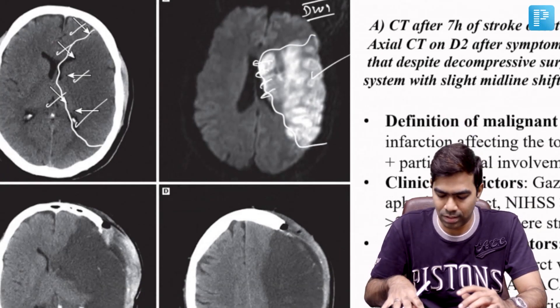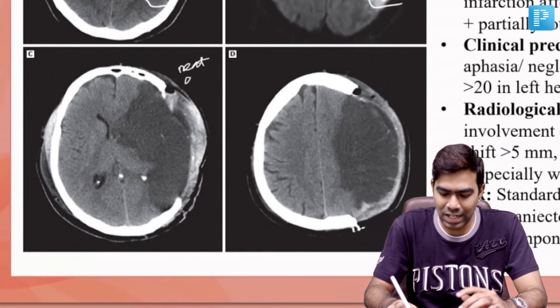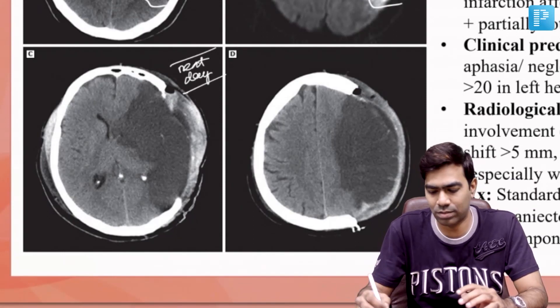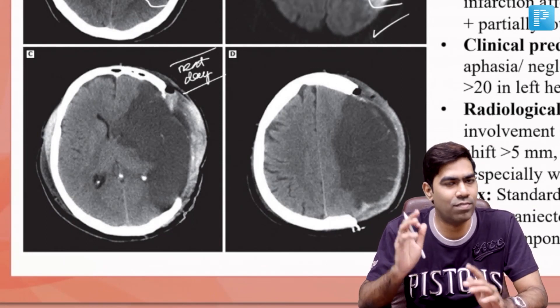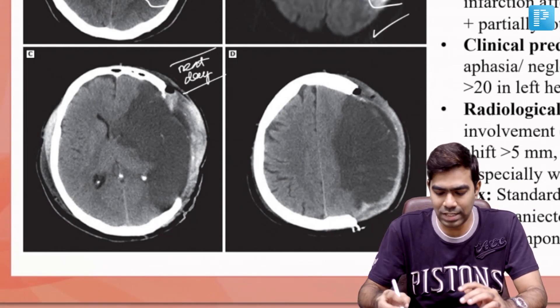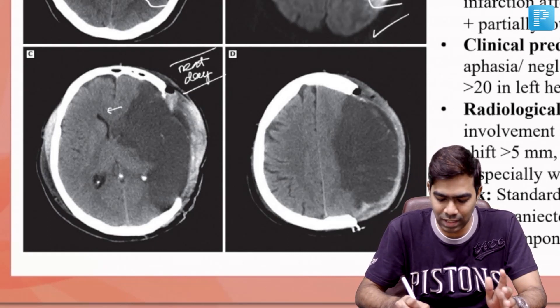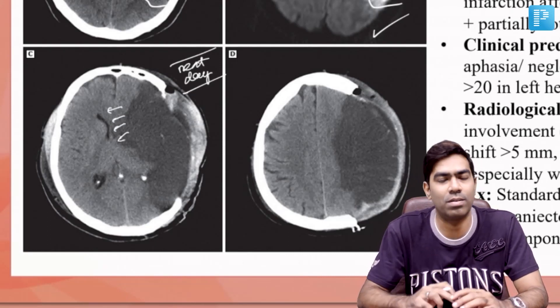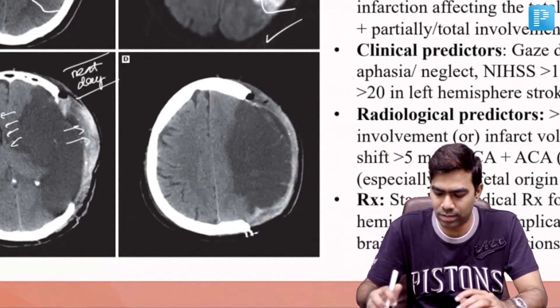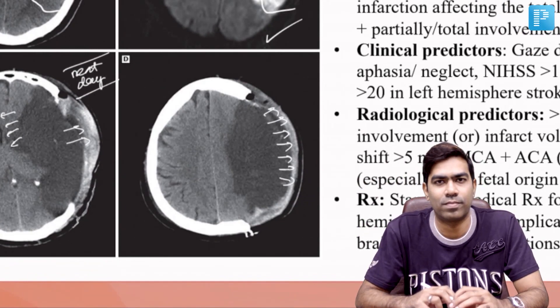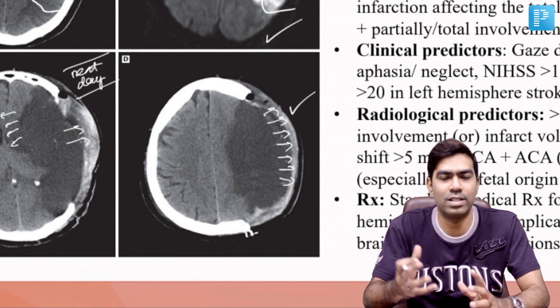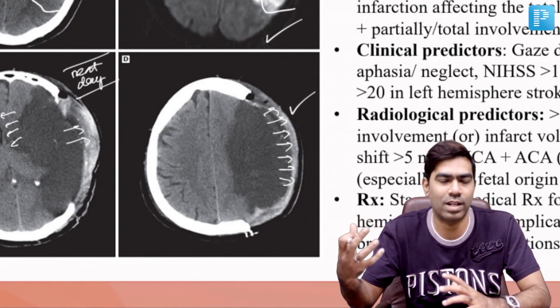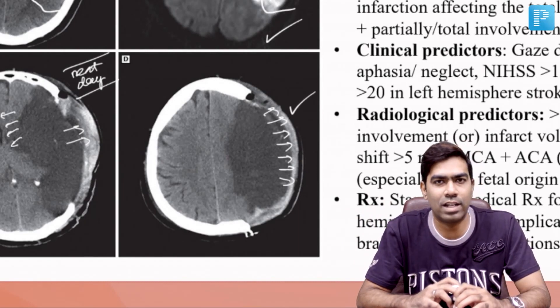This CT was taken the next day after hemicraniectomy, as this patient was taken for decompressive hemicraniectomy anticipating herniation. Even after hemicraniectomy, there is significant mass effect with some midline shift, but there is an outward movement of the edematous tissue. This is exactly why we perform hemicraniectomy — to allow the edematous brain tissue to expand outward rather than inward.